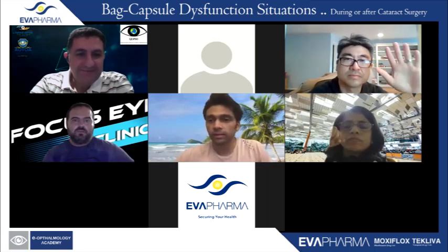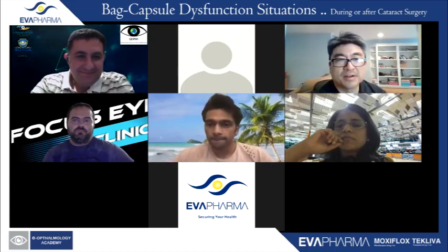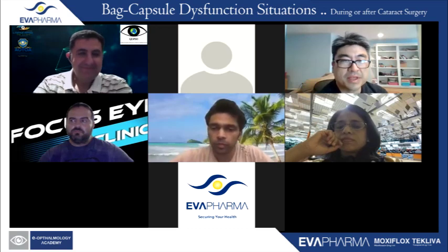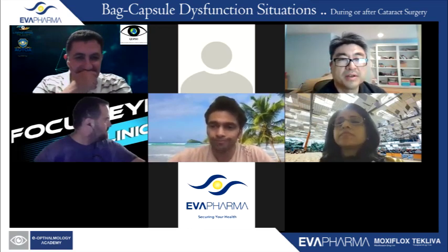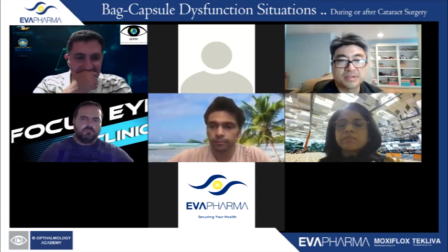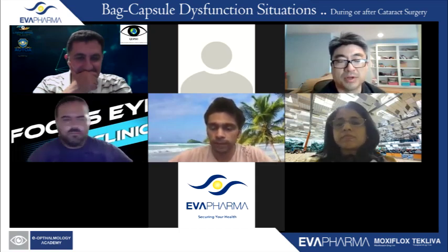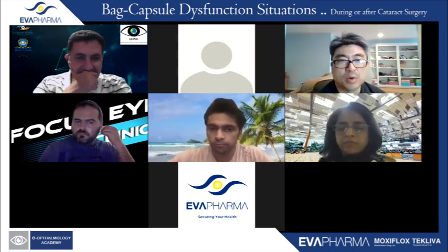Brian. Yeah, Brian. I also want to echo, great talk, Ashvin. I think the pupilloplasty is so important, like you said. Especially with these lenses, these are eyes that have been through a lot. When you have a dislocated lens, the pupils may not be quite symmetrical.